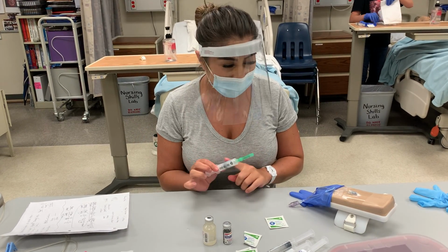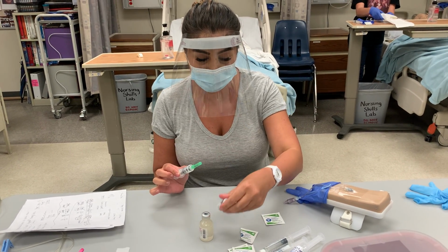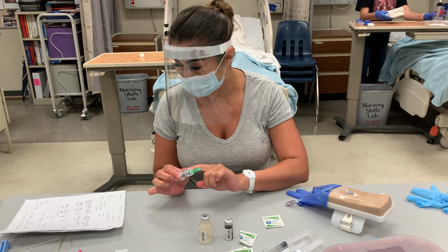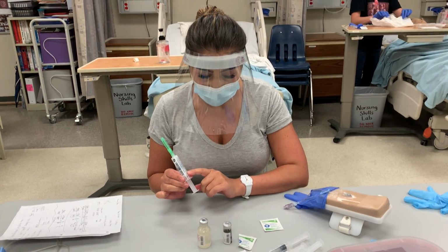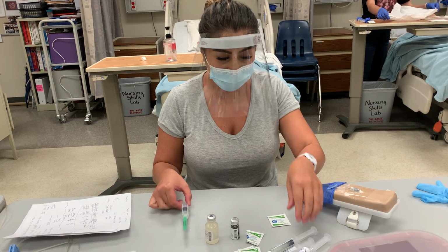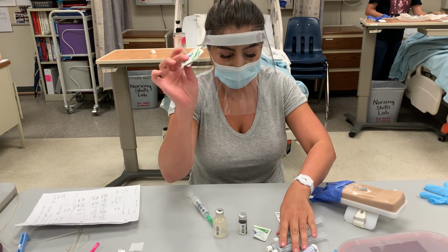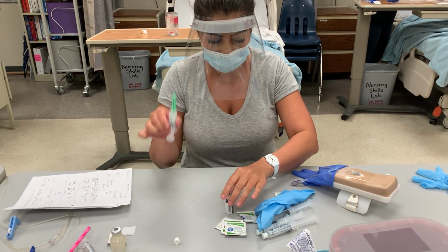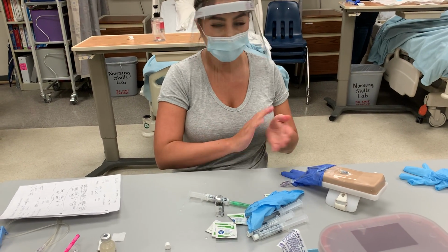I'm going to label my medication with my initials, date, time, and the medication is 4 milligrams of morphine in 6 mLs. So that's the total that I have in here. And my initials, date, and time. And I would take with me to the patient's room 3 of my normal salines. I'm going to take my alcohol swabs. I have gloves, my medication to scan, and my actual medication. So go to the patient's room, knock knock.